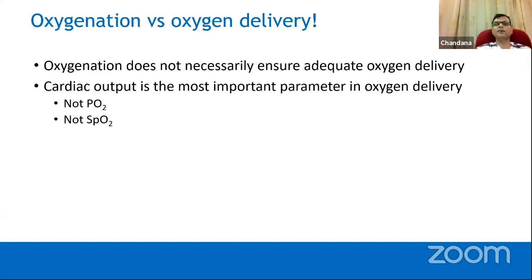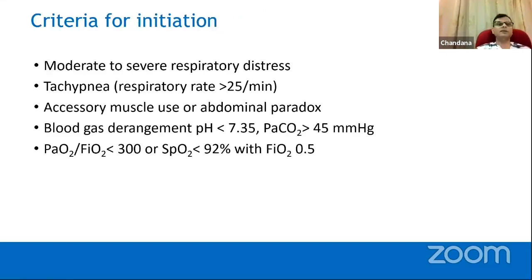Don't give furosemide when you get low urine output. When you apply high pressures, adjust the pressure, maybe come down a little bit, and give some volume, then maybe you can go up after that. Or you use some other drug where you will increase the cardiac output also. So that is how you should manage.